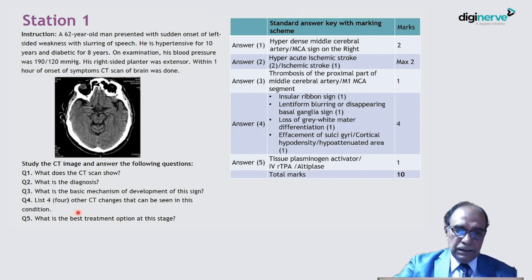Next, list 4 other CT changes that can be seen in this condition. In this condition means early ischemic stroke. So there are so many features of early CT changes. You can write from memory. That is insular ribbon sign.